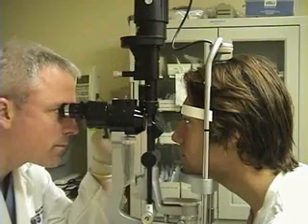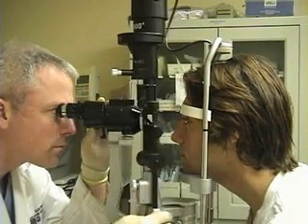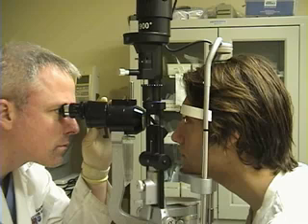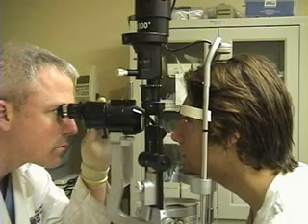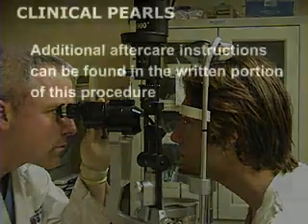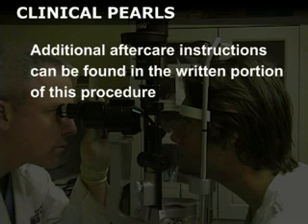Perform a slit lamp examination of the eye to assess for corneal injury and for particles embedded in the conjunctiva. Additional aftercare instructions can be found in the written portion of this procedure.